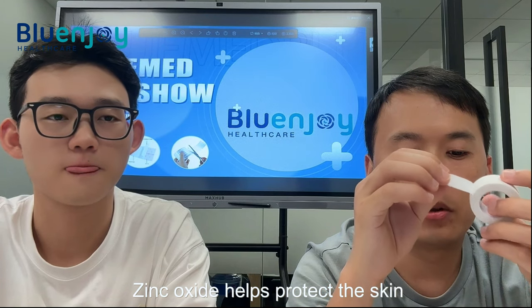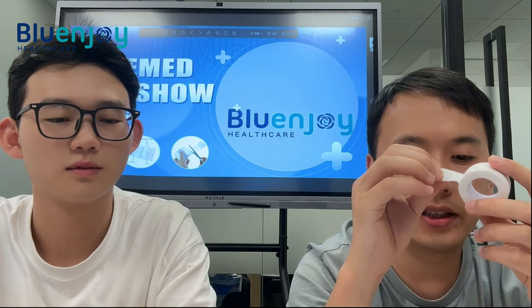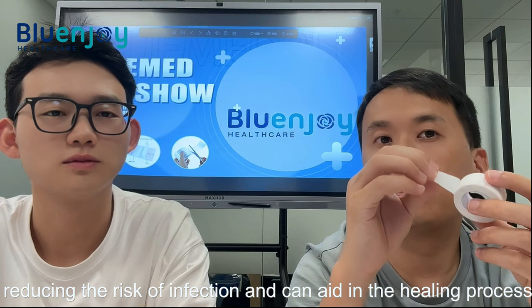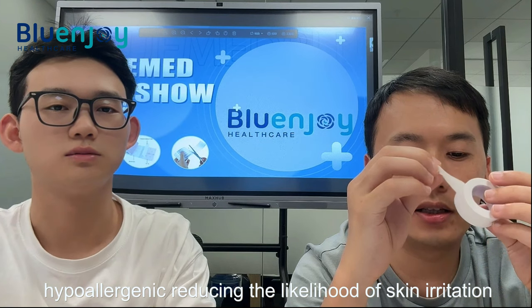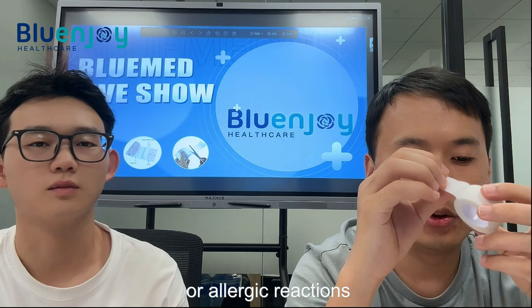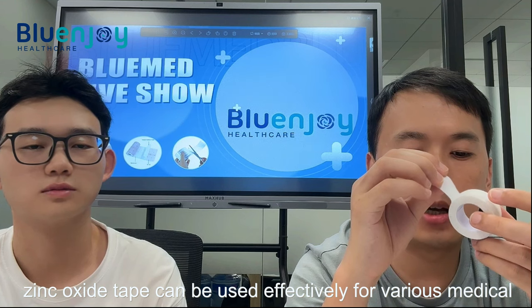Third, it has skin protection. The zinc oxide helps protect the skin, reduces the risk of infection, and can aid in the healing process. Fourth, it is often hypoallergenic, reducing the risk of skin irritation or allergic reactions.